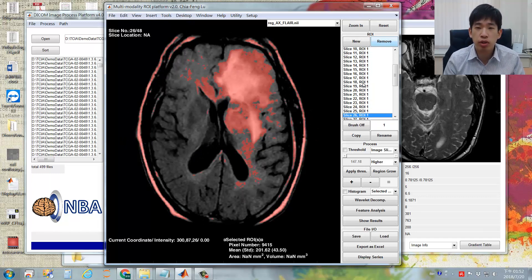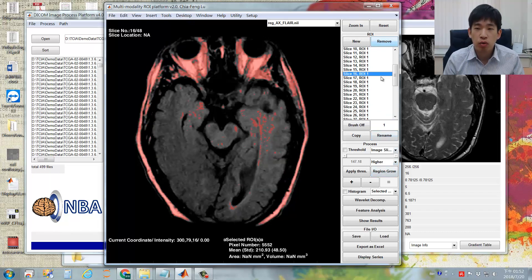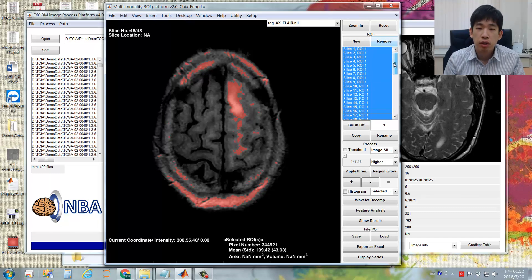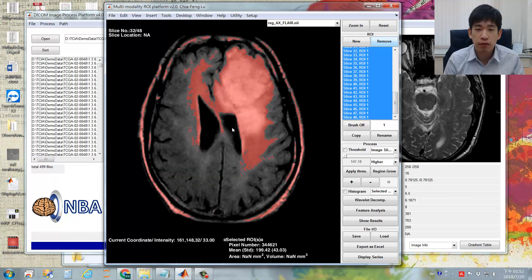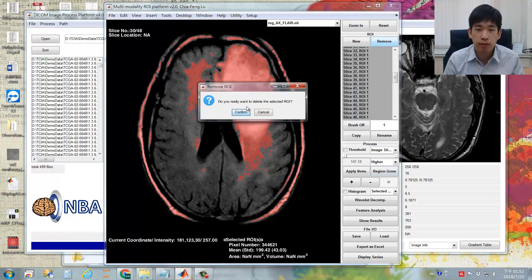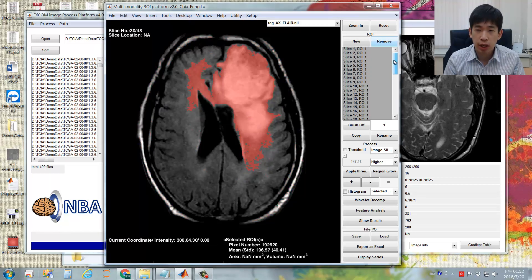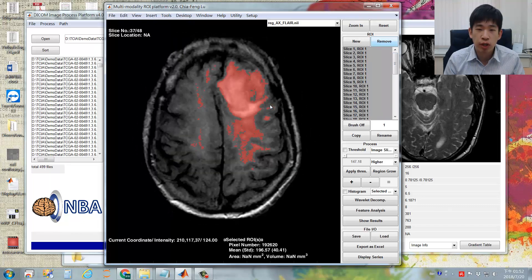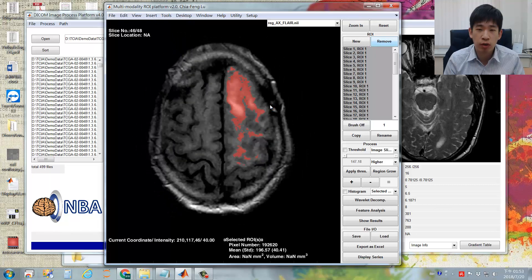To address this, use the Region Growing function. Select all ROIs — you can use Ctrl+A — then specify seed points and double-click. Wait a moment; a message will ask whether to remove the original ROIs. Press Confirm, and you will see that with region growing, most of the unwanted regions are excluded from the original ROIs.